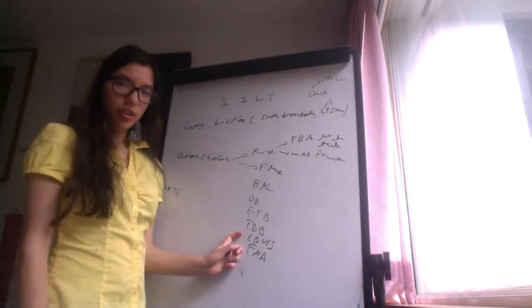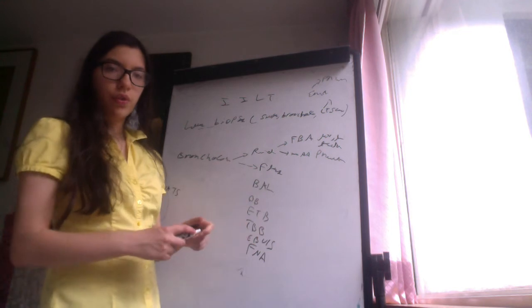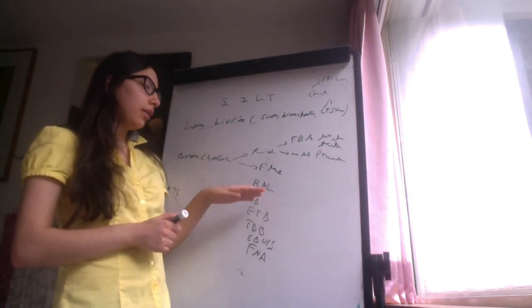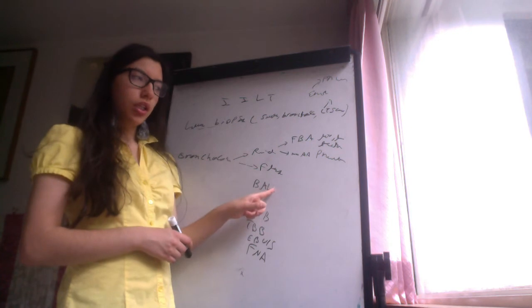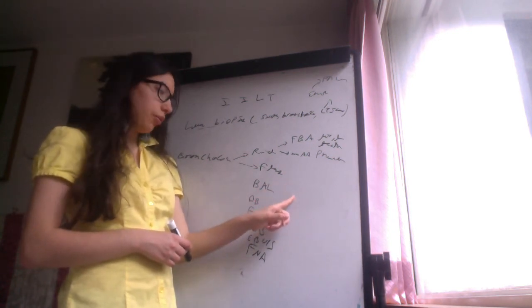Quickly, we have seen this in other videos. Remember, bronchoalveolar lavage is you infuse saline solution through the tube and you collect that. This is done for diffuse infiltrations in immunocompromised patients, diffuse non-infectious diseases, non-resolving pneumonia, or suspected alveolar hemorrhage.